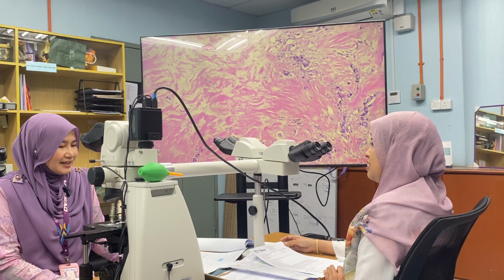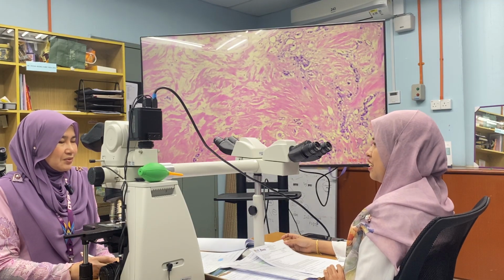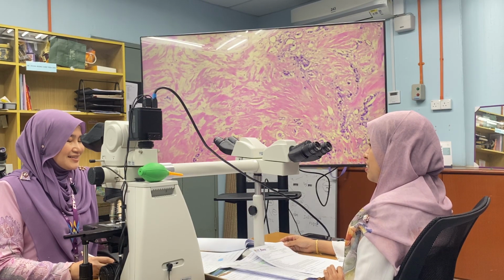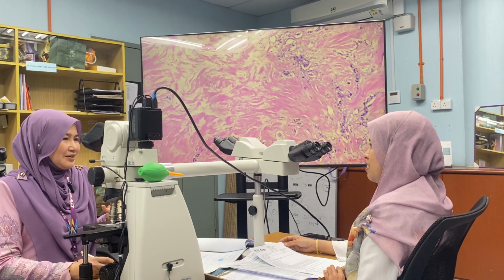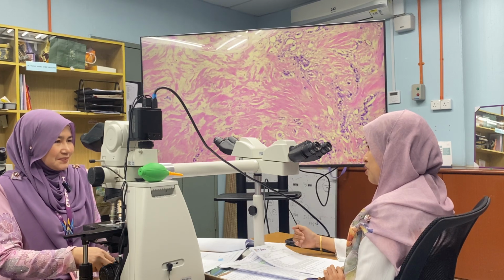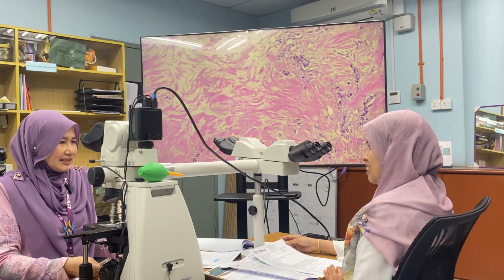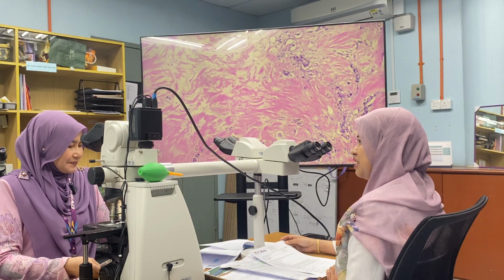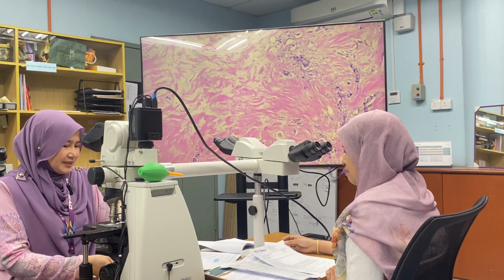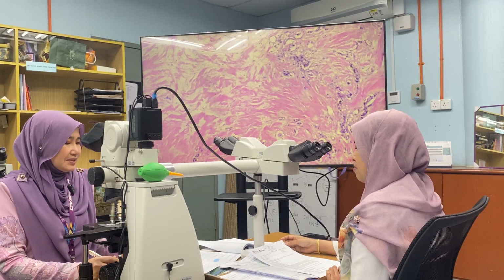Ki-67. So what about the Ki-67 in this case? In this case, it's low. I count about 1%. 1% Ki-67. So what is the significance of the percentage of Ki-67? What percentage do we take to consider it positive? For luminal A and B, luminal A is less than 14, luminal B is more than 14. You said 14. It's not 20. Based on my unit it is 14, but I will clarify back with you after this. All right. Okay. Maybe we can take 20%. But of course, in this case, it's negative. So it's luminal A with a low risk. All right.